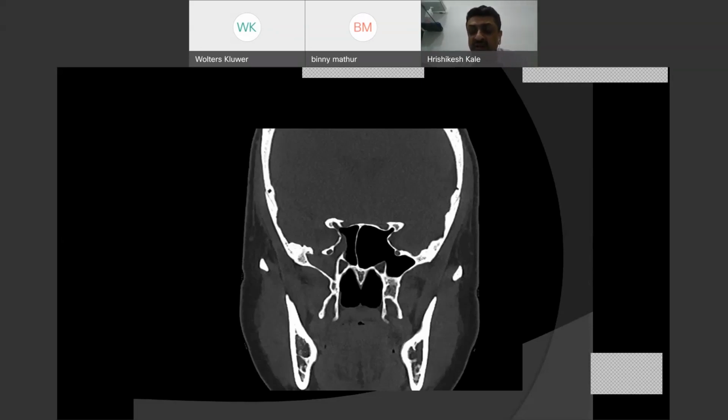The increased intracranial pressure was seen as the presence of an empty sella, dilated CSF sleeves around both optic nerves, and papilledema. And then through this defect in the lateral recess of the sphenoid sinus roof, there was herniation of brain contents and meninges with a CSF leak. So I'd mentioned to you that in patients with SIH, you can have low, normal or increased intracranial pressure. Some of these probably fall in this category where they are intermittently having leaks, and one of the causes of the SIH is increased intracranial pressure.